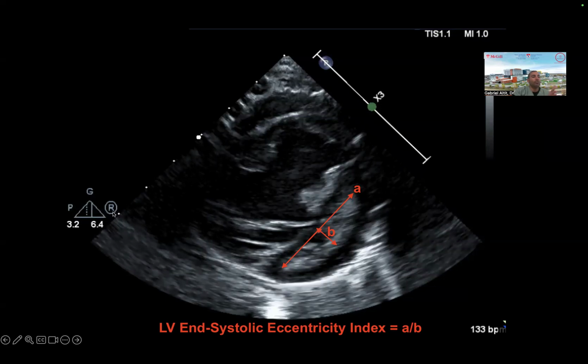It tells you that on your probe, you selected a range of frequency that is in the resolution space, which means that you're using the higher frequency of the probe. So I already know that this is probably a 6S or 9S or 7, probably a 6 from the Philips. And it tells me that during this echo, we used more of the 6.4, 6.5 megahertz range to get a bit more resolution.